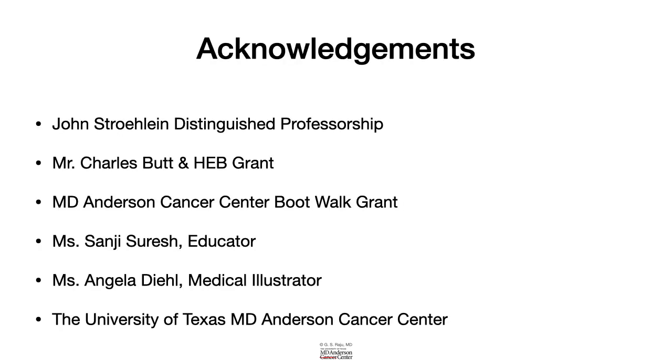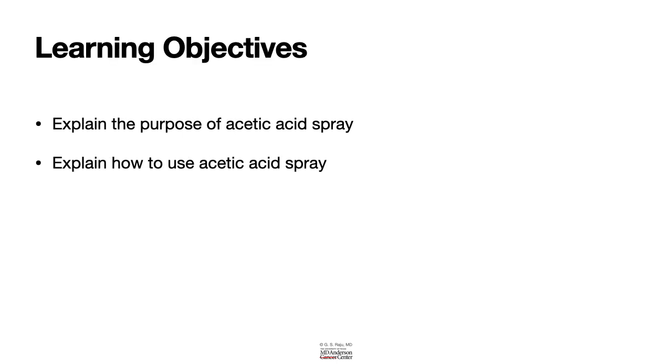These are my acknowledgements, and today's learning objectives include the following. Number 1, we will learn about the purpose of acetic acid spray, and number 2, how to use acetic acid spray in gastrointestinal endoscopy.